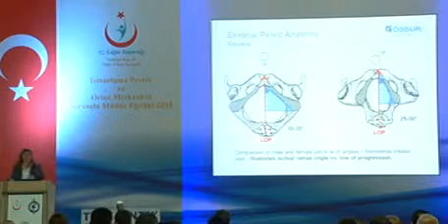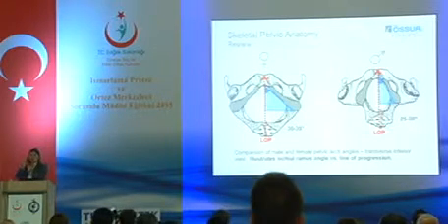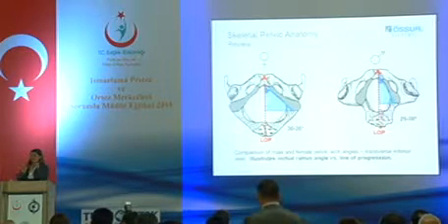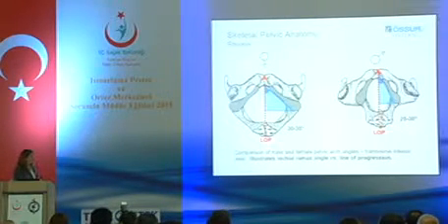We of course also need to make sure that we get our line of progression so that we know later on when we're rectifying that our cast is in the correct position. So we need to make sure that we take this into account when we cast as well.